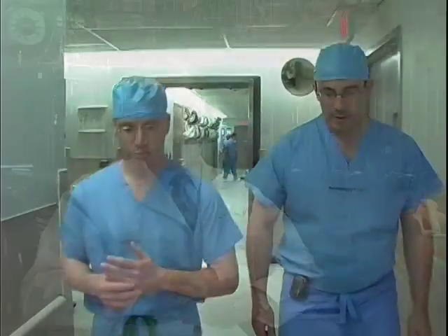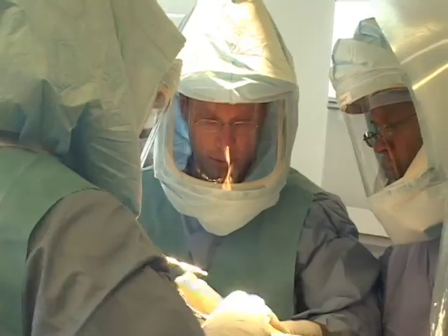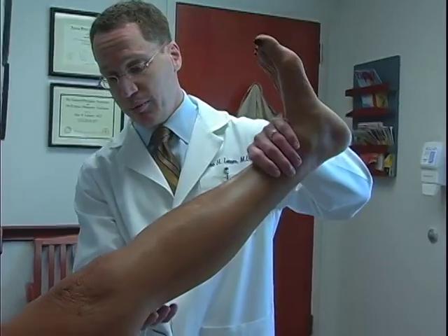The biggest advance with minimally invasive techniques that makes them different than how we approached a knee 5 or 10 years ago is not necessarily in the implants that we're using, but in how we approach the knee and how we get the implants in. The biggest change has been in the surgical approach and in the instrumentation, which allows us to get into the knee joint through the smaller incision. If we can get these implants in through a smaller incision, we know that if the patients are doing well at 1 year, they should have the same track record that we have with our traditional total knee replacements. And that track record has been exceptional in 90% of patients at 10 to 15 years.